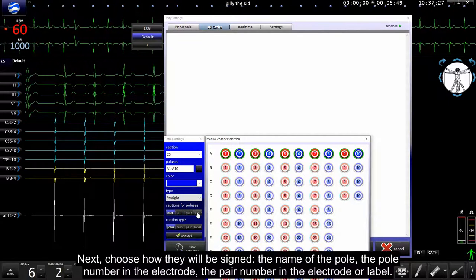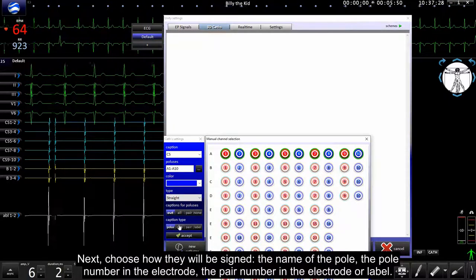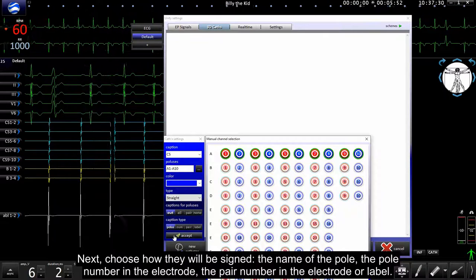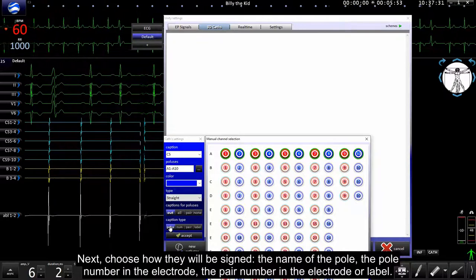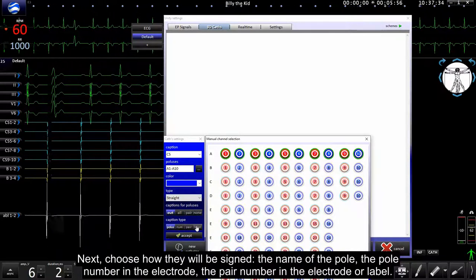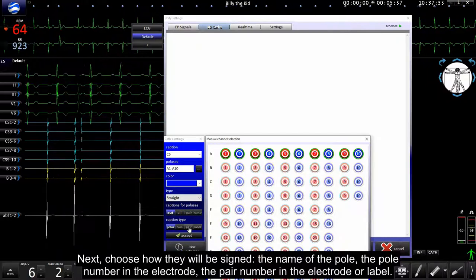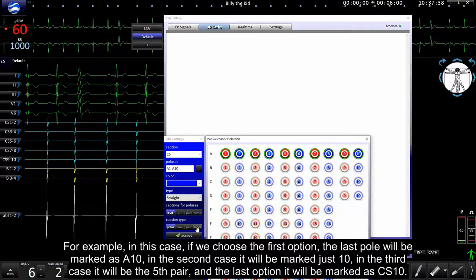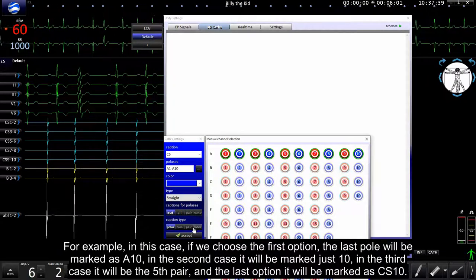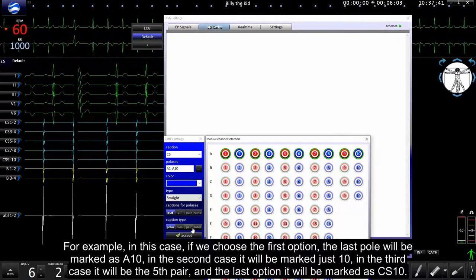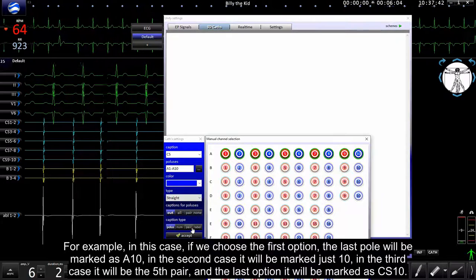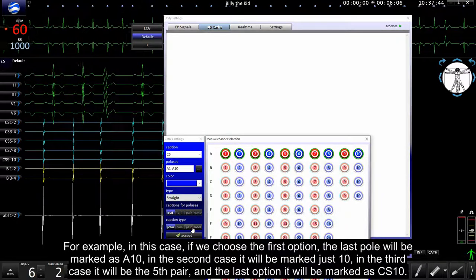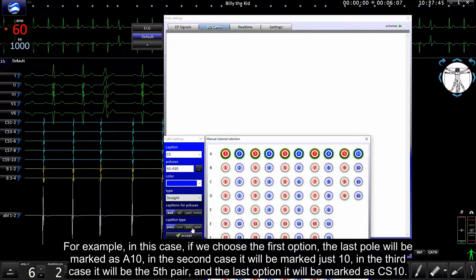Next choose how they will be signaled: the name of the pole, number of the pole in electrode, the pair number, or label. For example, in this case, if we choose the first option, the last pole will be marked as A10. In the second case it will be marked just 10.